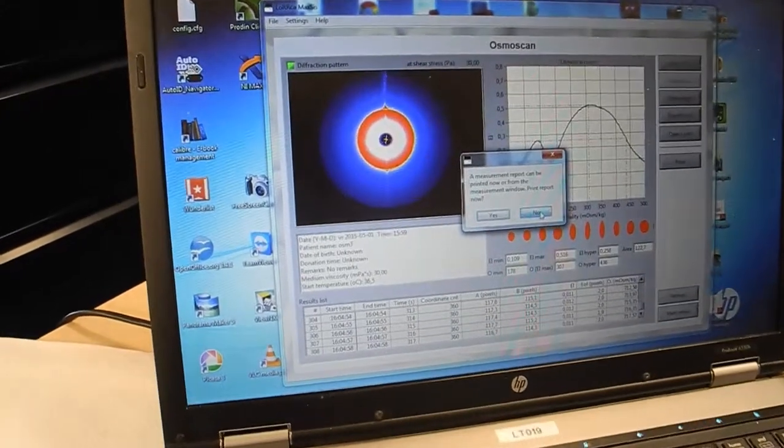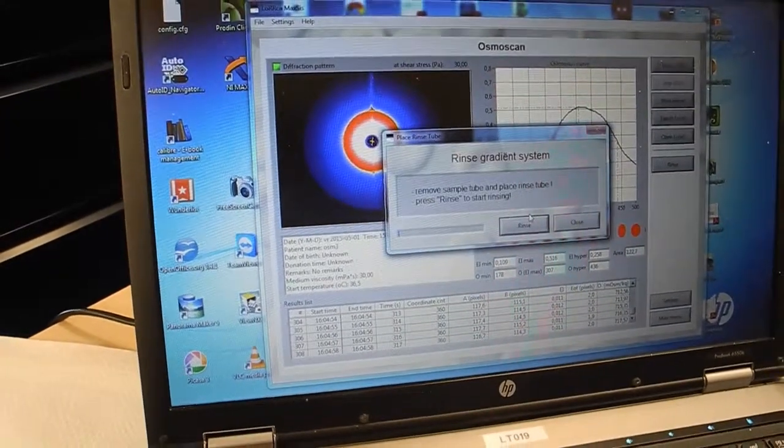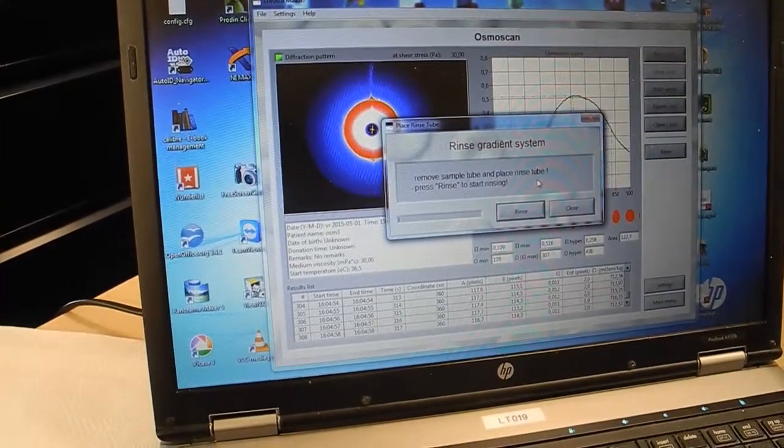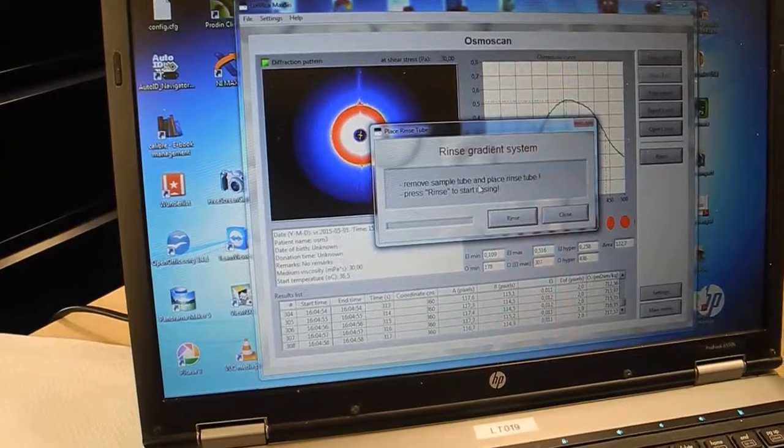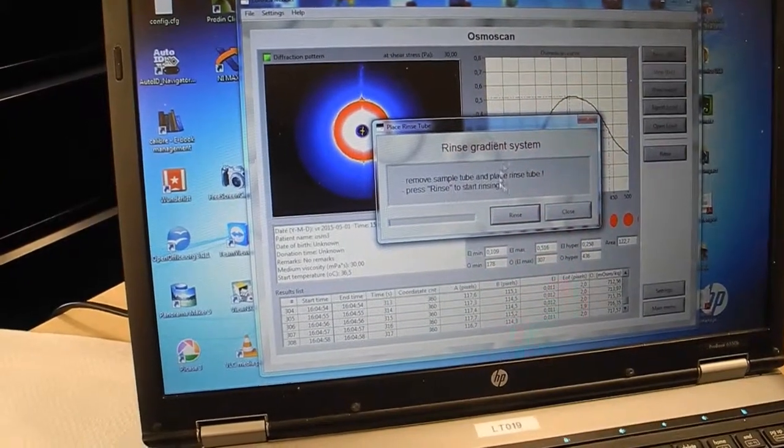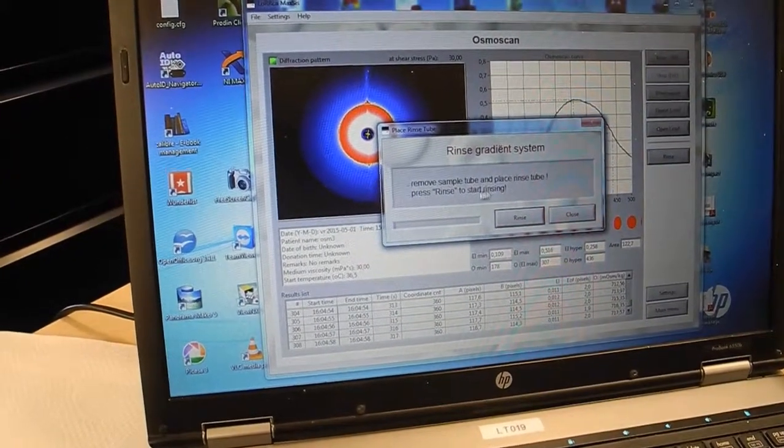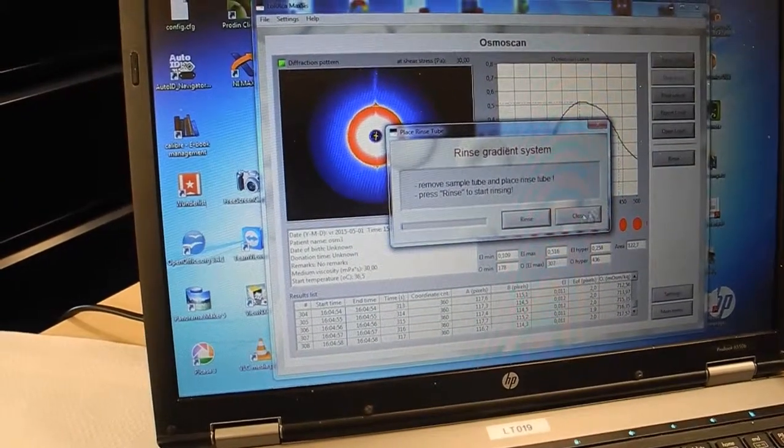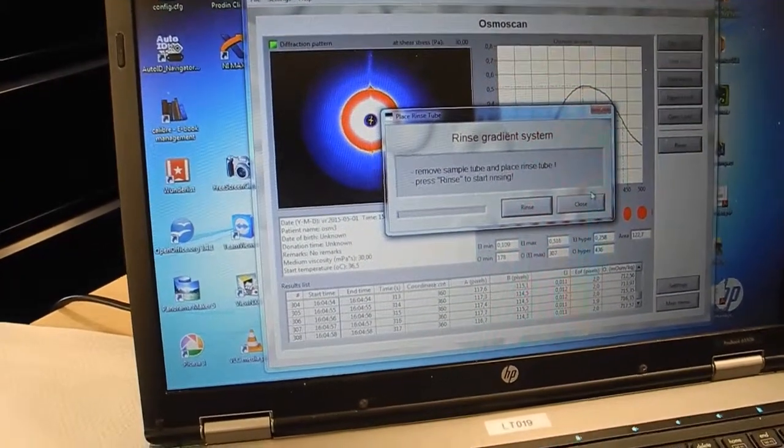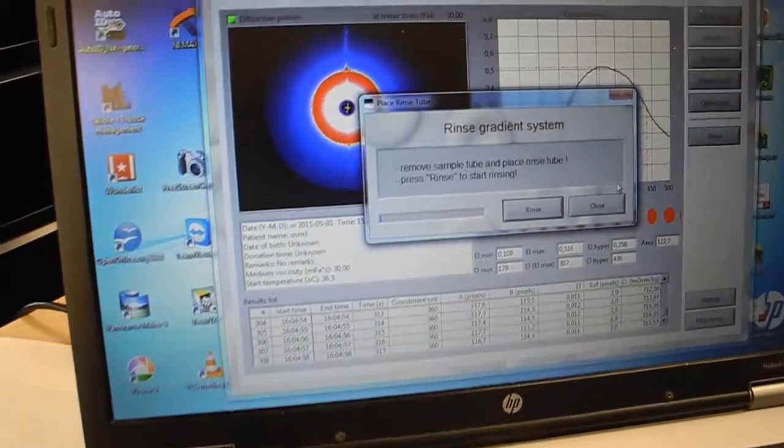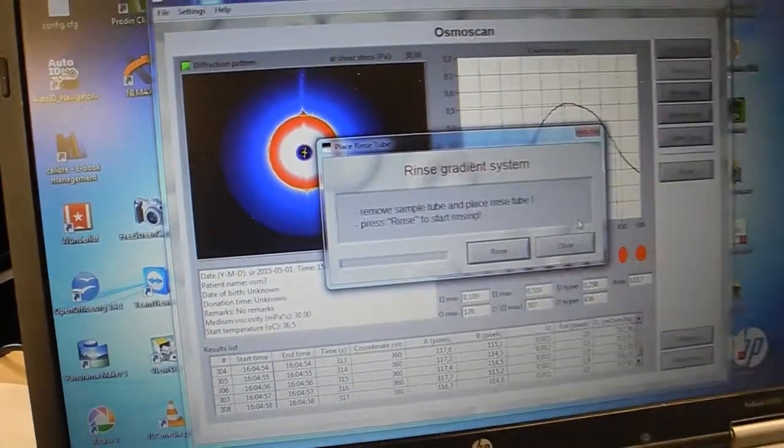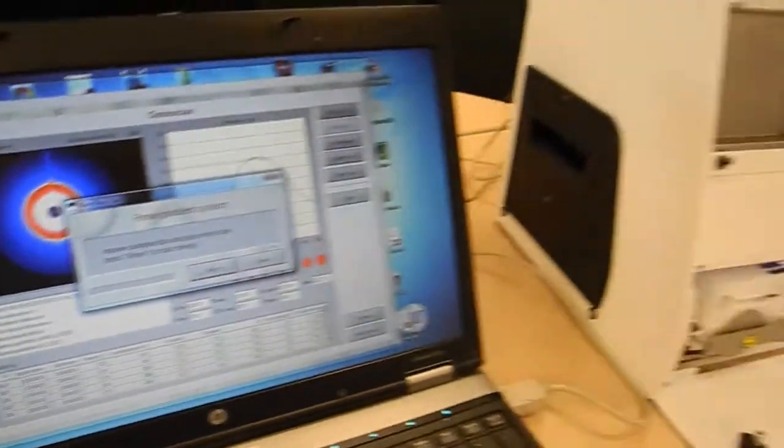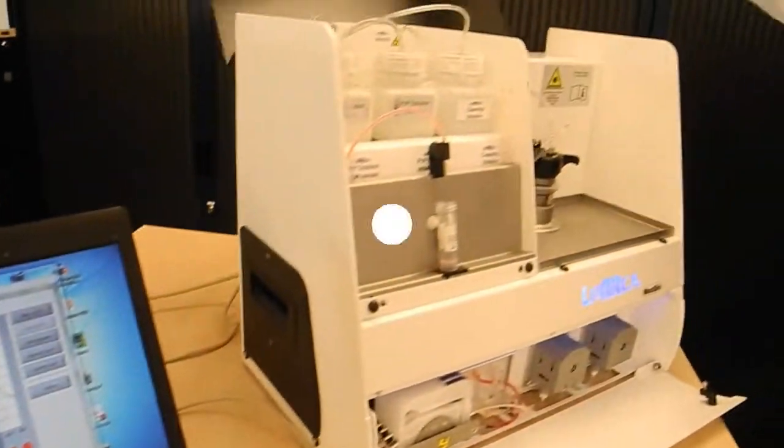We can remove the sample tube and rinse the system or run another sample, but this time we will rinse it.